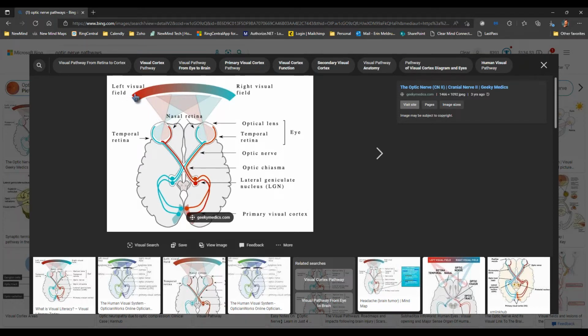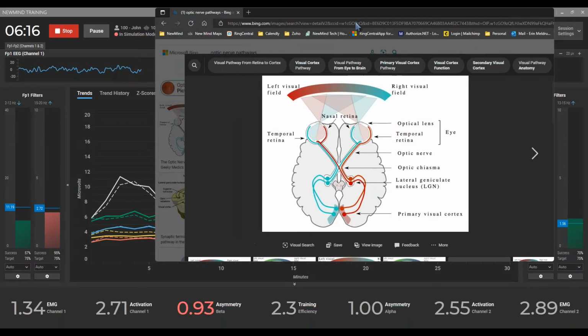Okay, that's nice. So in our photic glasses, when you see those, you'll have two LEDs sitting to the left of the eye, and you'll have two LEDs sitting to the right of the eye. So we have the left visual field, and as the lights on the left visual field come in through the eye, those are going to cross over and hit this nerve receptor on the right side of the eye. That photic light will be carried down that optic nerve, coming in here at O2 and then cascading up through the brain. And then the right eye field crosses over and hits this nerve receptor on the left side of the eye. We see that being carried down here, coming in at O1, and then moving up through the brain.